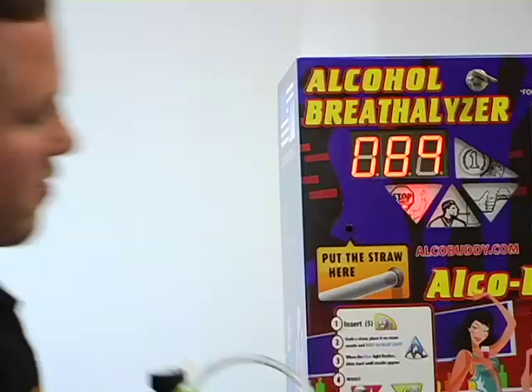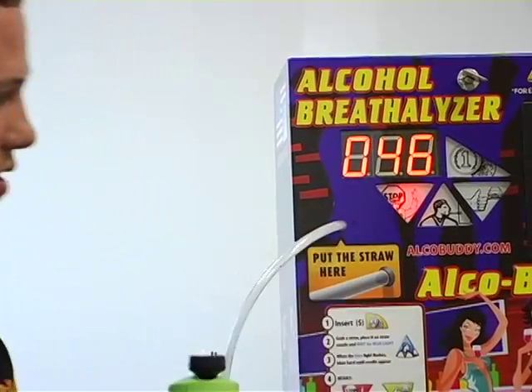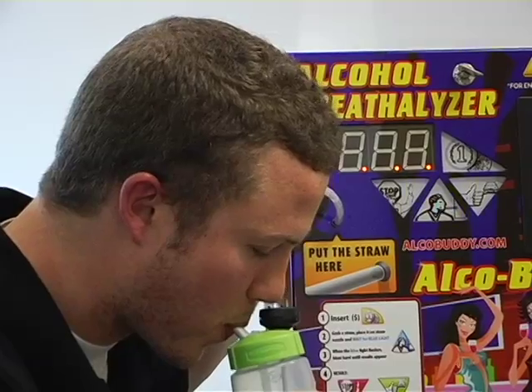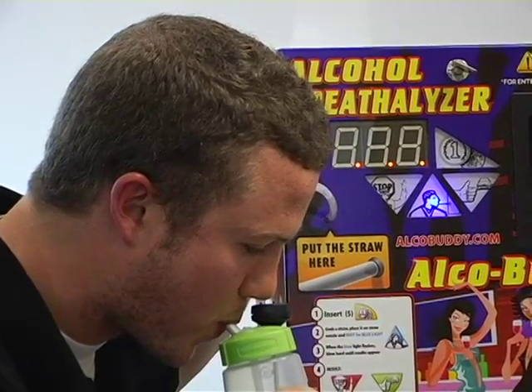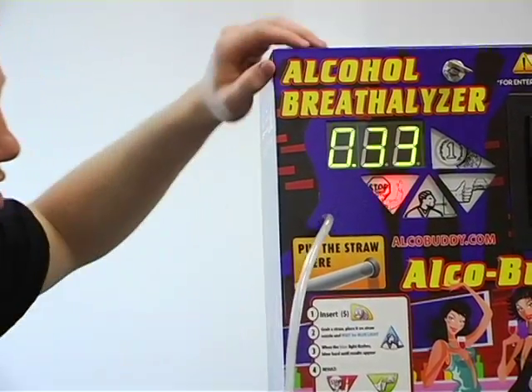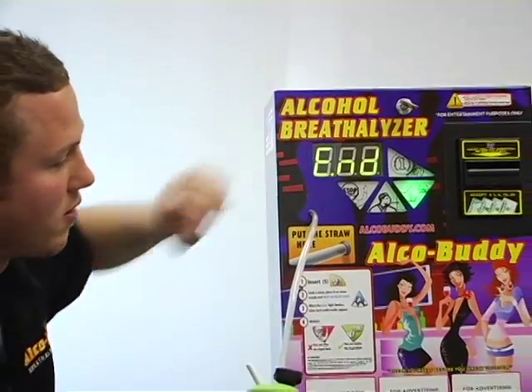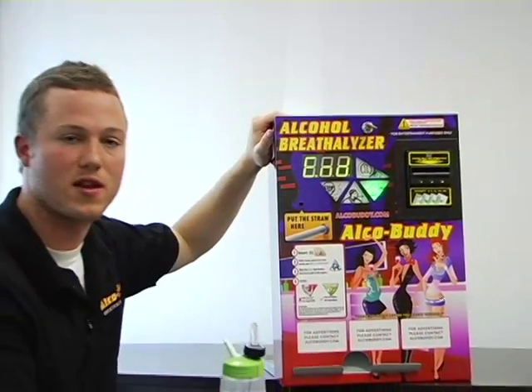We will wait for the next 10 second countdown, hook up the tube, and get ready to blow. Perfect — as you can see, we hit our range: 0.33. In that case it flashes green and will also show 'end.' That means it is saved, and now the machine is calibrated and ready to go.